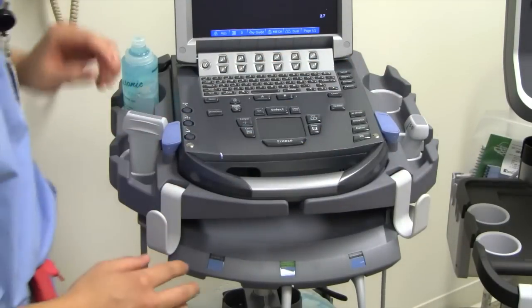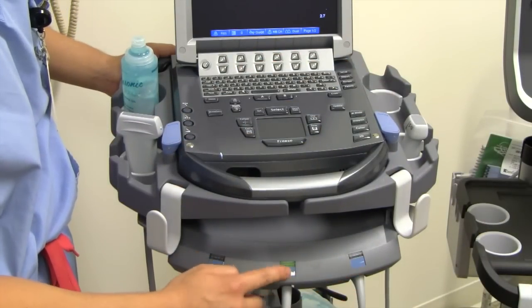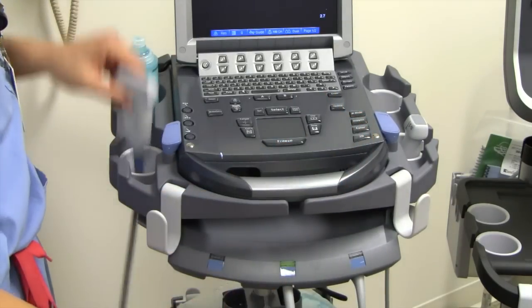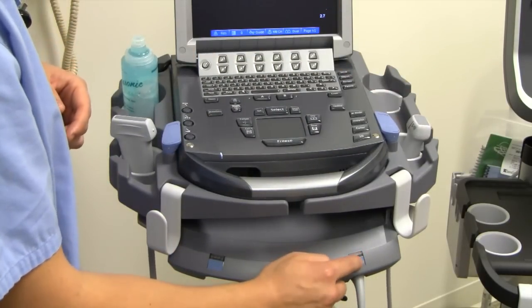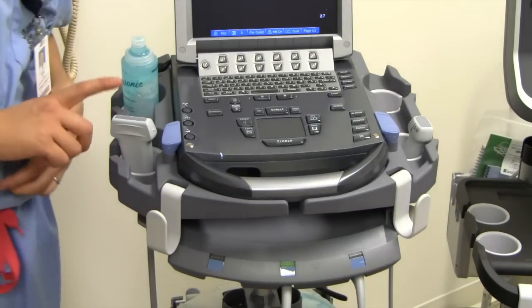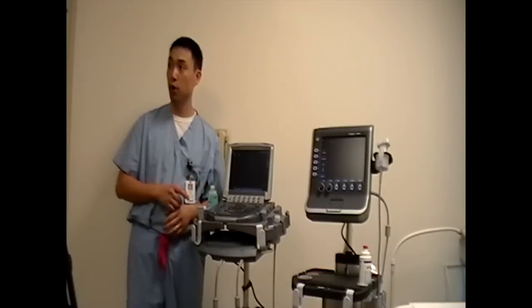To select a probe on the M-Turbo machine, there are buttons down here. The green light means that's the probe that's selected, and you can follow the line up to see where the probe is. Same thing with the phased array probe — you just push this button and it'll switch over to that probe. For the most part, you're going to be using the linear probe in the beginning, and then as we get better and move along, we'll start using the other probe.